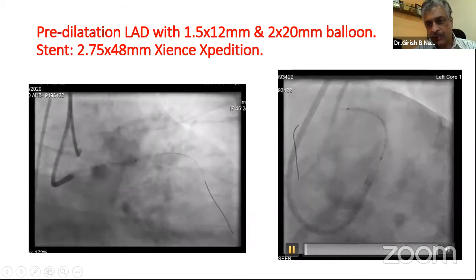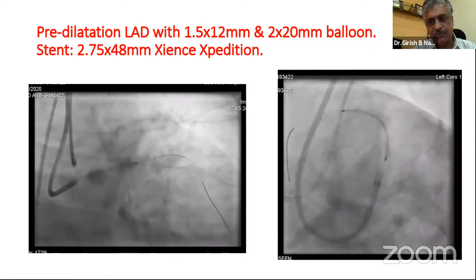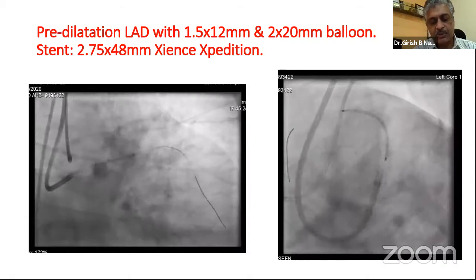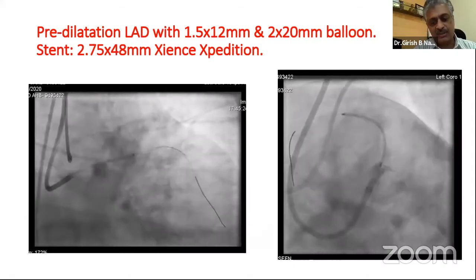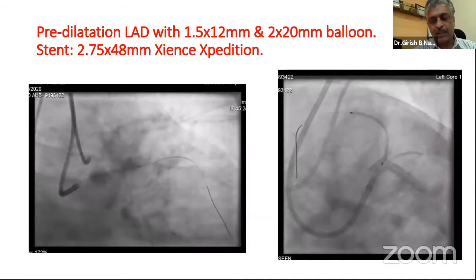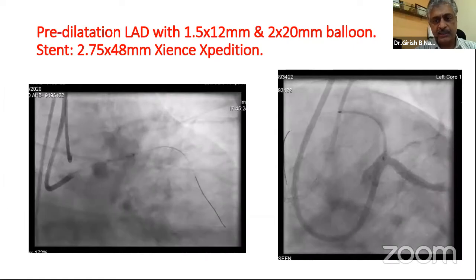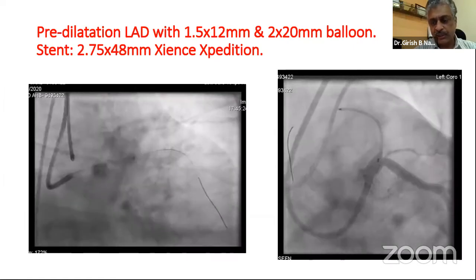And this has been a practice for us, that we always make sure that a couple of struts prolapse or extend beyond the circ ostium. For whatever in the future, you can always do a POT in the left main, but completely cover the ostium of the LAD. That's been the principle at our center whenever you do an ostial lesion.